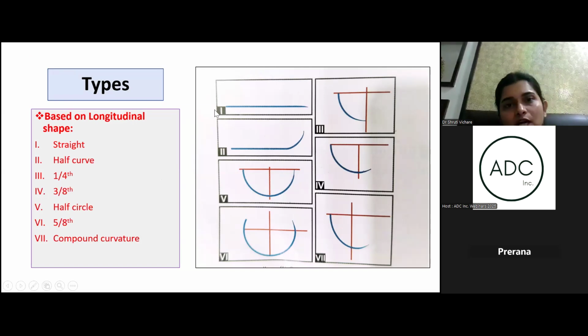Having said that, do we use these types of needles very commonly in our practice? We don't. But they can be used, and they have been used for extraoral suturing. We can use them only in areas where adequate space is available, because it does not have any curvature, so we need broad space. If you have broad space available for suturing, you can make use of these, although not very commonly. So in accessible areas with adequate space, you can make use of these sutures.